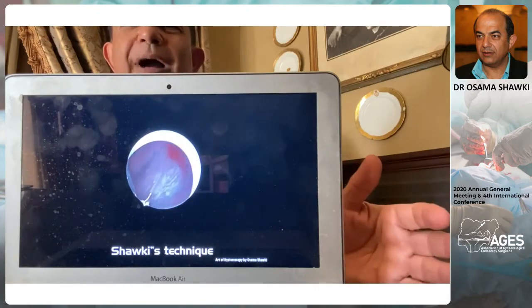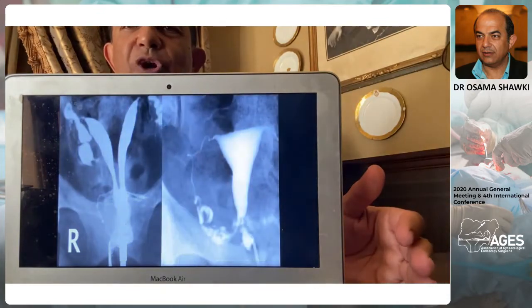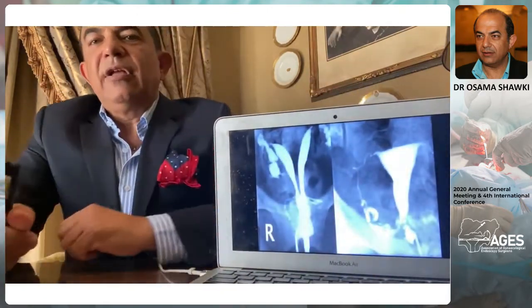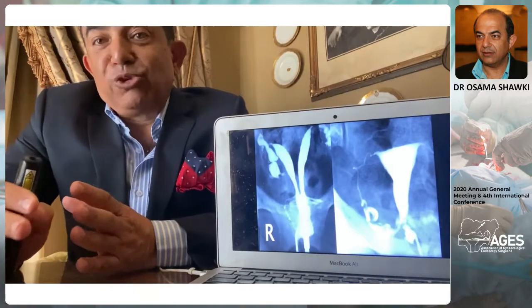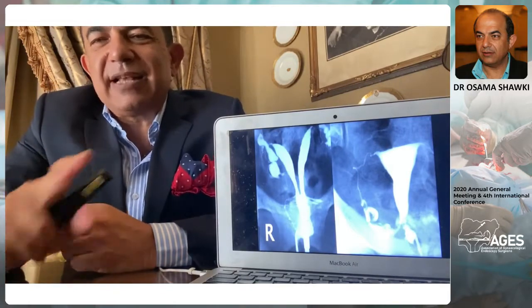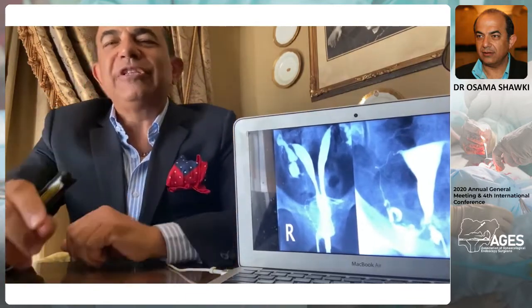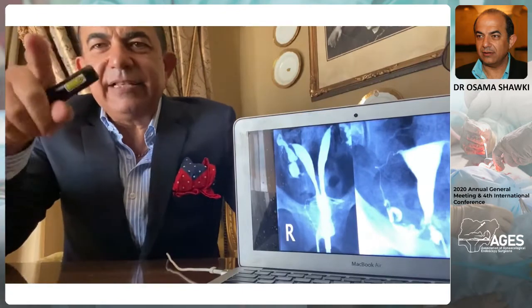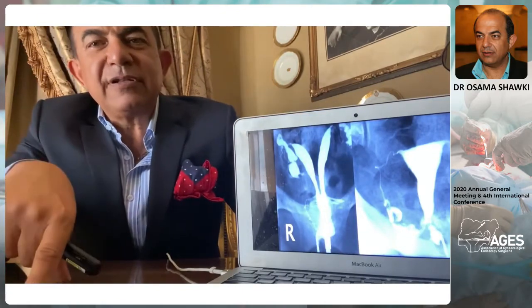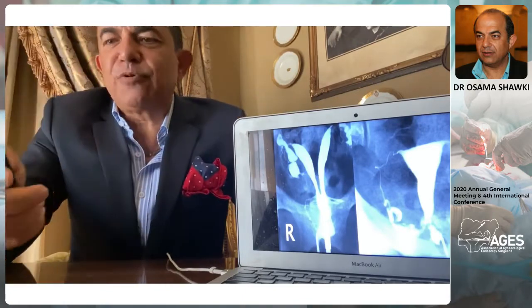You have a big white area, which is the septum bed. And 2 months later, we do hysteroscopy. You have a beautiful cavity and total reconstruction. I can speak about the septum for 2 hours, but they give me only 20 minutes. So, right, septum is not just cut and forget. Please don't underestimate the skills needed for septum surgery. Listen, my friends, the procedure is called metroplasty. It is a plastic procedure.